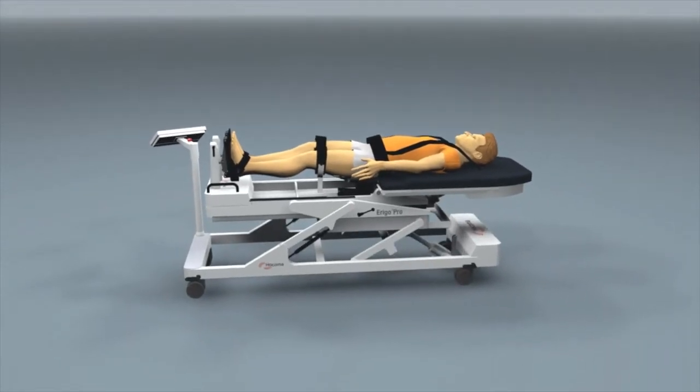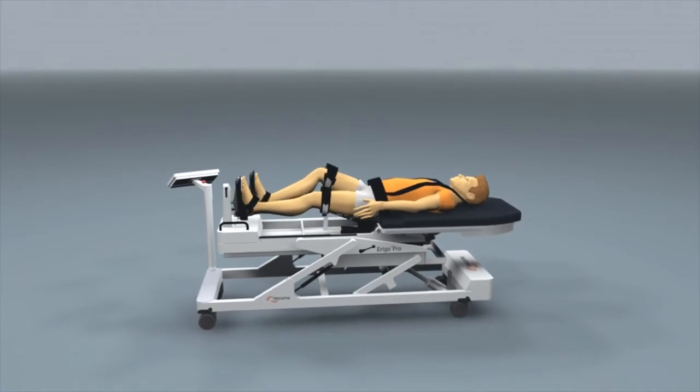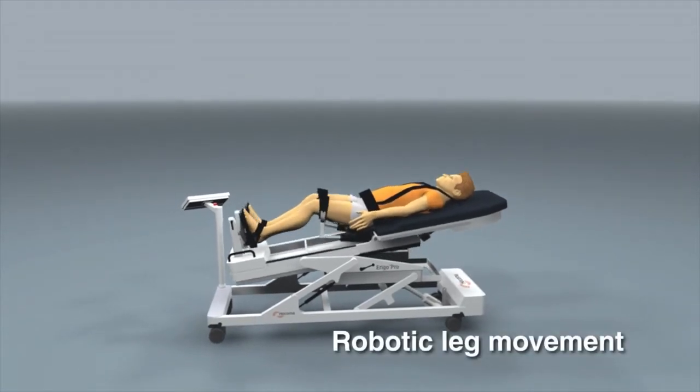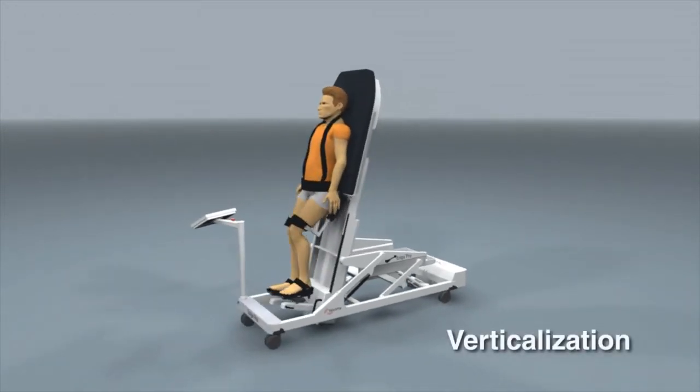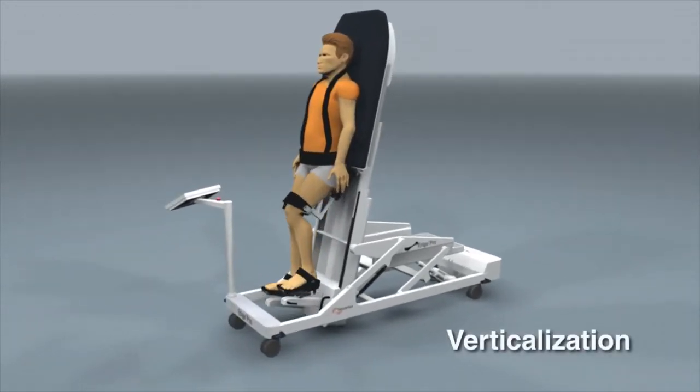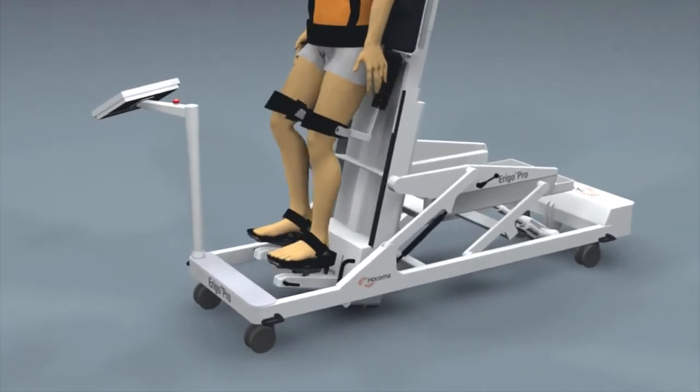Hocoma's Erigo is a robotic device for safe and early mobilization of neurological and bedridden patients. It combines robotic leg movements with gradual verticalization and provides intensive sensory motor stimulation.